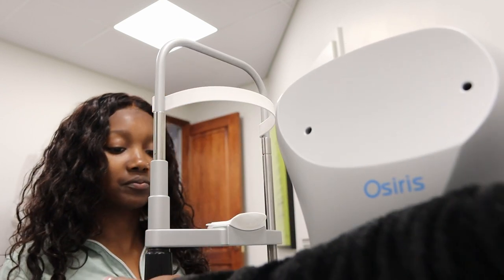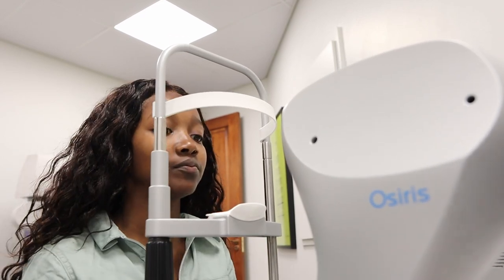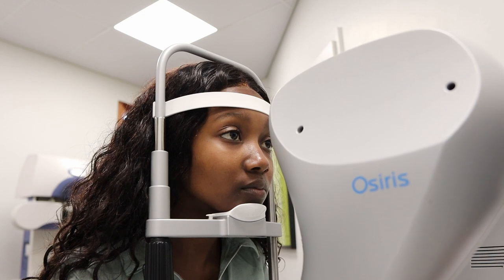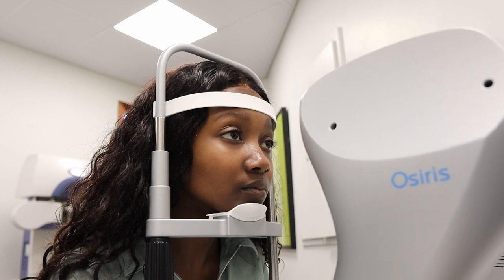Just sit back for me, please. I just need to adjust this a little bit. Cool. Okay, you can place your chin on the chin rest. Yeah, that's much better. Just keep looking at the light inside the machine, please. You'll see it just now. Mm-hmm. Perfect. Moving to your left eye.